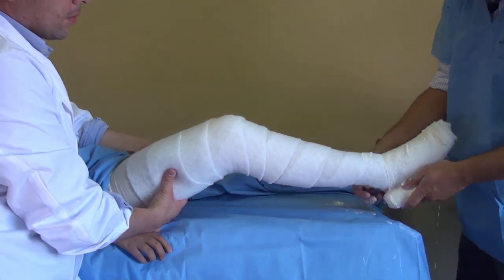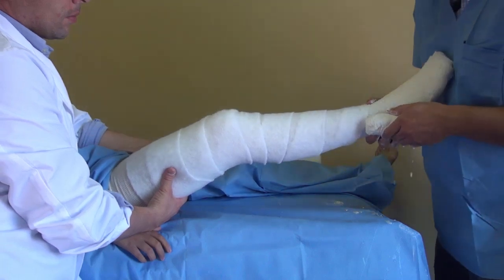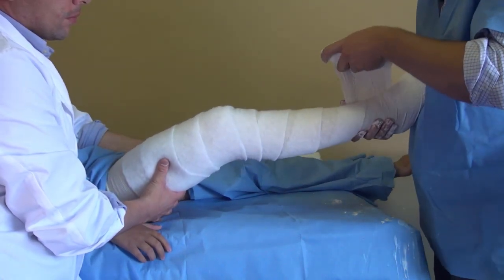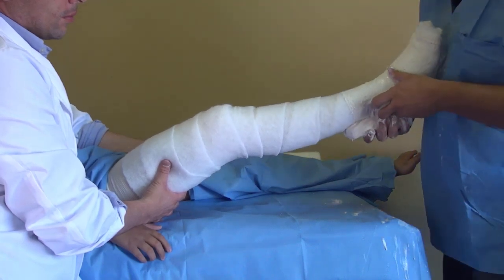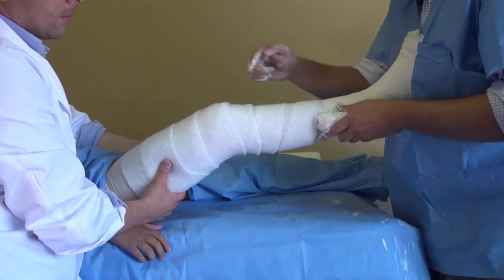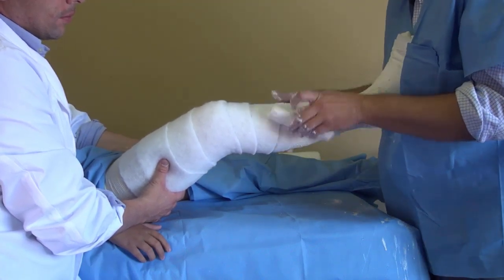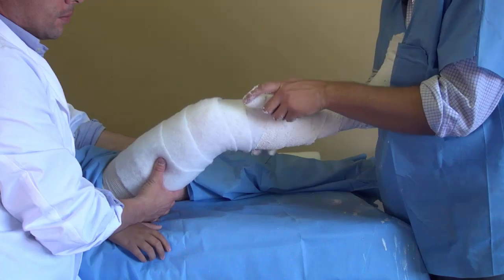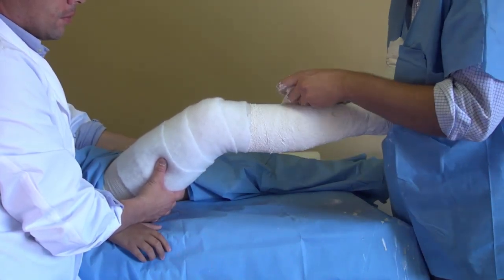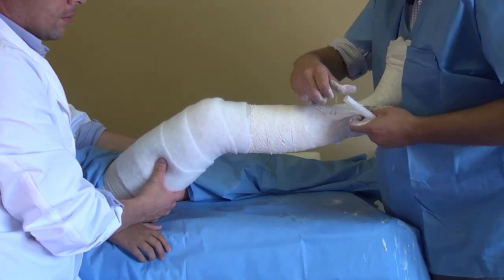Make sure you're very close to the leg — don't take it off like this. You can use your chest to position the foot and get the right position. Going up just below the knee and now going down again.